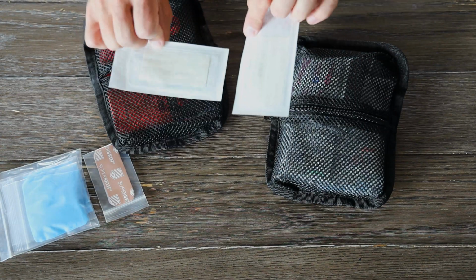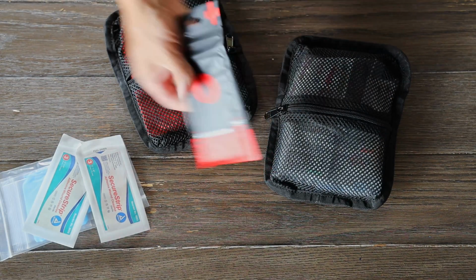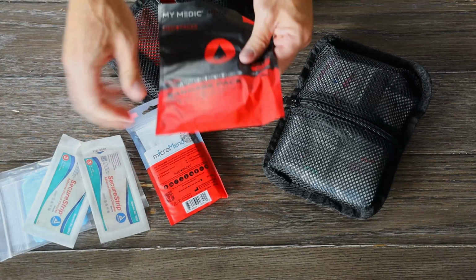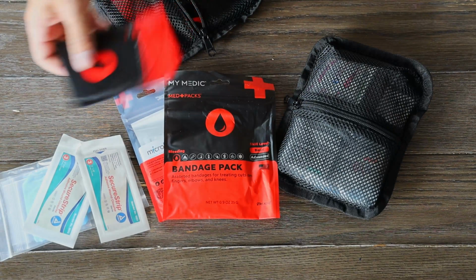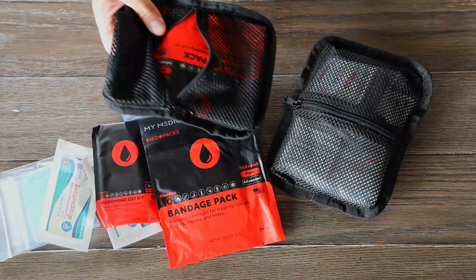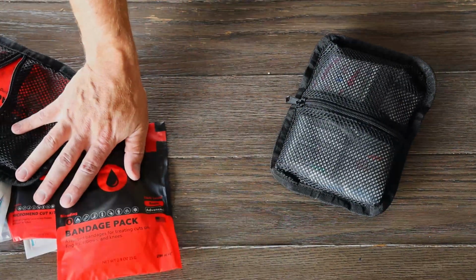Secure Strip adhesive wound closures. You've got a couple micro-mend cut kits. So these are ways to secure a cut if you end up not having sutures available. Bandage pack, assorted bandages for cuts. It says fingers, elbows, and knees. Another micro-mend kit and another bandage kit in there. Again, these small pouches could be very useful if you want to set your chest seal stuff in one of them, or like this, certain number of bandages. So right now this one's set up to treat small cuts.